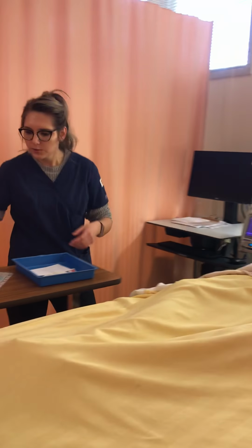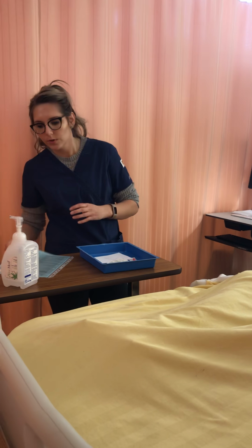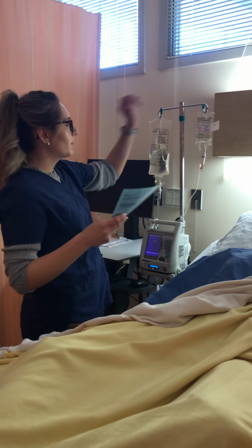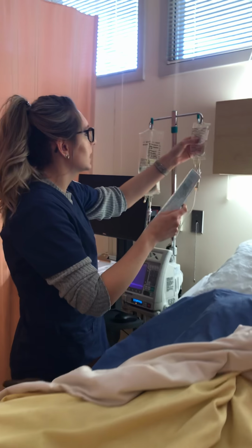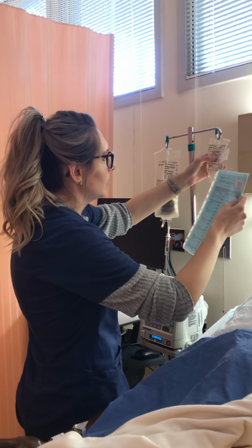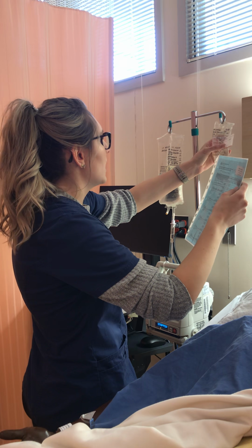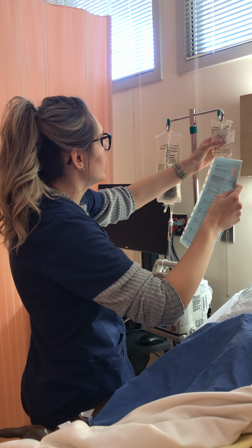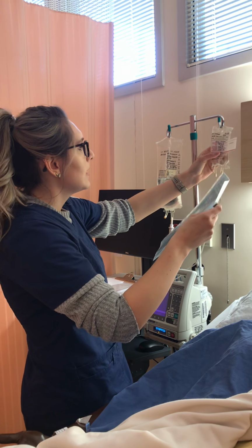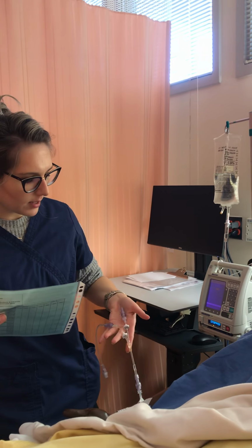Okay, so I'm just going to do some hand hygiene here, and I'm going to perform my first check. So I've already confirmed with my doctor's order on the monograph. So I'm just going to take my MAR here, and it's going to be my MAR to my prepared medication that the second nurse has already done. So right patient, Bryson, Scotland, right drug, insulin R, Humulin R. The volume in here is 101 milliliters, so I have 100 units with the right dose, and then the concentration is 0.99 units per ml. The time is now, and the route, as the doctor has prescribed, is going to be through the peripheral IV.